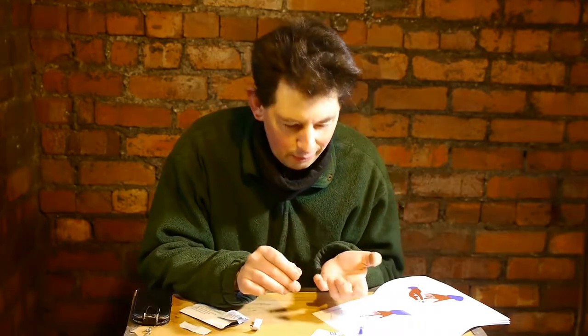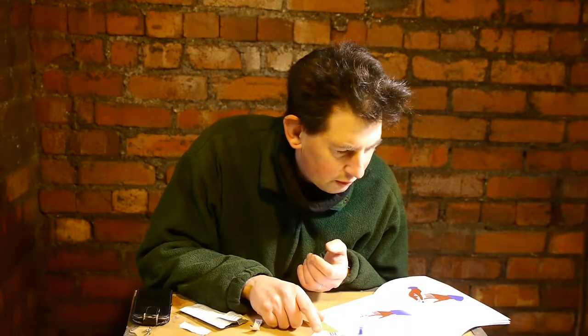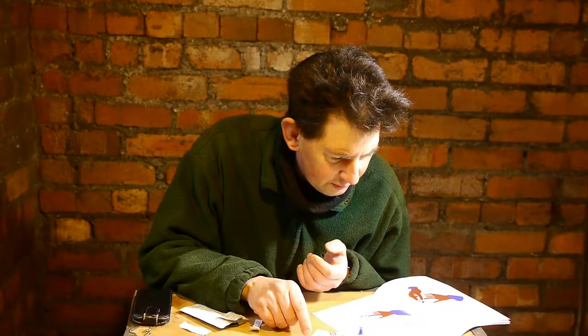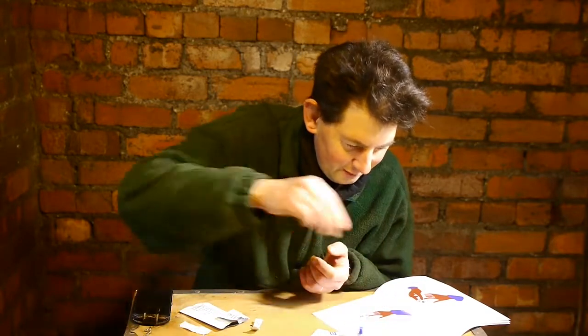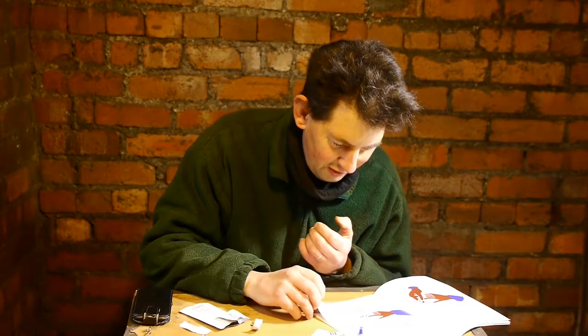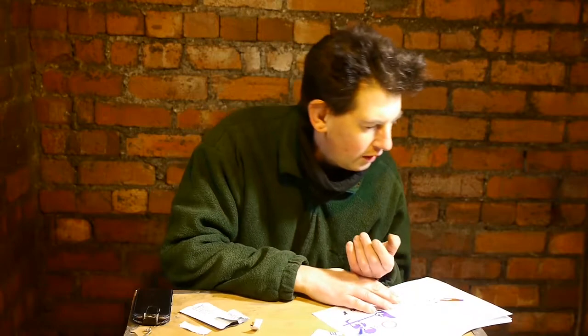I was going to warn people to look away when the blood was coming out. Make sure the blood covers the bottom of the thing. Yeah, I've done that. If you don't get enough blood, repeat the prick. Oh, there's blood on this. Ugh, blood everywhere. With a different finger. I guess the pipette would let me suck up some blood if I wanted to.